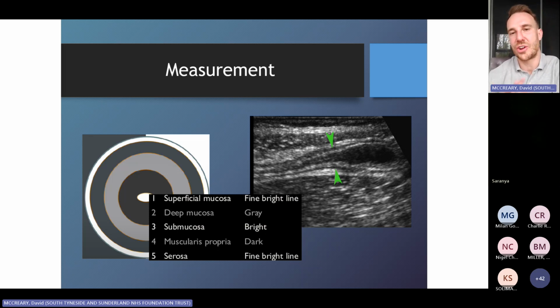What I would say about the cutoffs and about 6 millimeters is that if you're really quibbling over 1 or 2 millimeters, so 6, 6.1, 6.2, or 5.9, and you're having to convince yourself that hard, I don't think, in my experience, I'm too worried about those cases. As I say, this tends to be fairly binary when you've got your patient in front of you. You're either nowhere near 6, so you're 0.2 of a centimeter, 0.3, 0.4, 0.5, or you're way above, 0.7, 0.8, 0.9, 1 centimeter, 1.1, 1.2, something like that, in my experience.